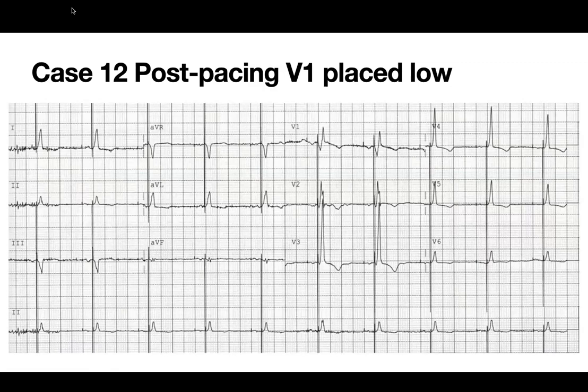And there are 2 publications after regarding the presence or absence of R prime in V1. They're reporting it as being 5% of cases, but there are 2 ways of exposing whether or not an R prime is present in V1. One of them is pacing at lower outputs, and then the R prime could be present. That's the one from Ponnusamy. Someone was referring to that earlier. And there's another one from Mastrosky, who was saying you do a train with a PAC and a PVC, a premature one, to see if you see the R prime, but I don't think anybody does that. But I think the position of V1 is useful also.